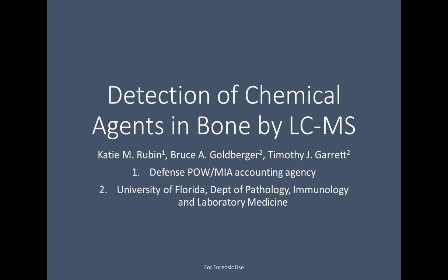Dr. Garrett, our first question from our audience member is, you use a combination of high-resolution mass spectrometry and traditional tandem mass spectrometry on a triple quadrupole. Do you think that the high resolution can also be used in quantitation instead of the traditional triple quad? Well, Susie, thank you. That's an excellent question. The triple quad is a mainstay in the clinical lab. Most instrumentation there is used for quantitative analysis, so it's not going to go anywhere.